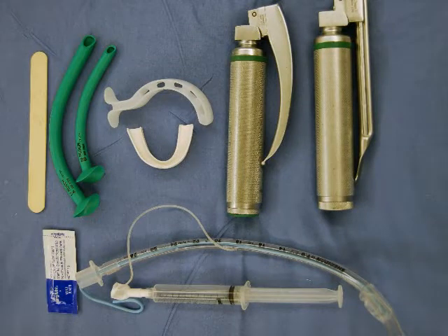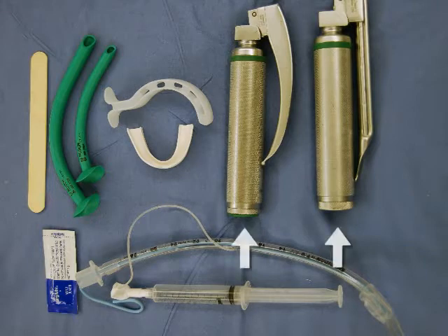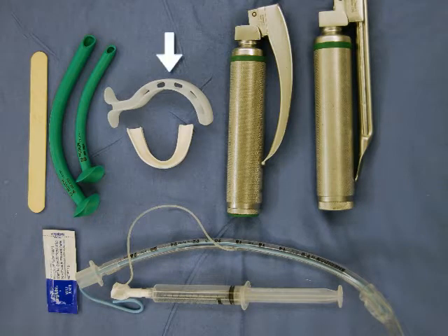Ensuring that airway equipment is available prior to the procedure is critical to a successful intubation. Obtain two laryngoscopes with blades and check to ensure that the light bulbs and batteries are working. You will also need an oral airway, a nasal airway, a dental guard, lubricant, an appropriately sized endotracheal tube with stylet, and a 10 milliliter syringe. A tongue depressor is optional.